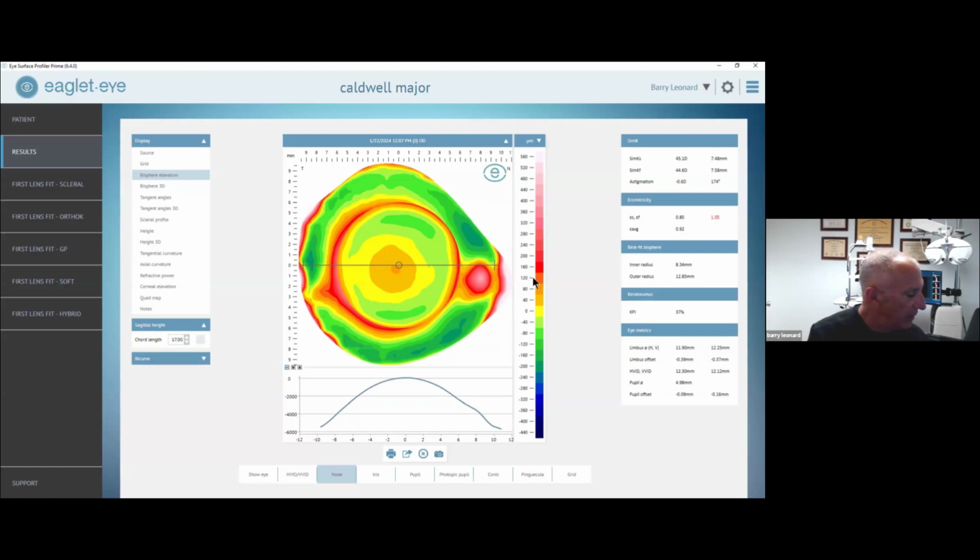And Johnny, if we go back to the presentation, if you look at a picture, and this began before I had Eaglet, and we were doing sort of older kinds of lenses without vaults and channels, or maybe just notches, we would sort of eyeball it and say how big something was. But we can certainly do a better job now.